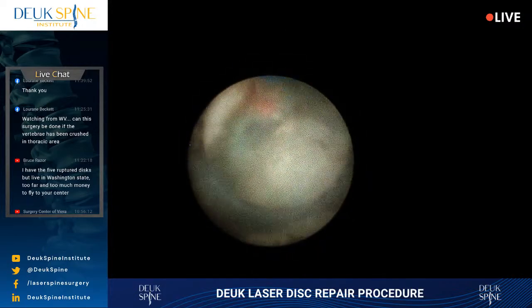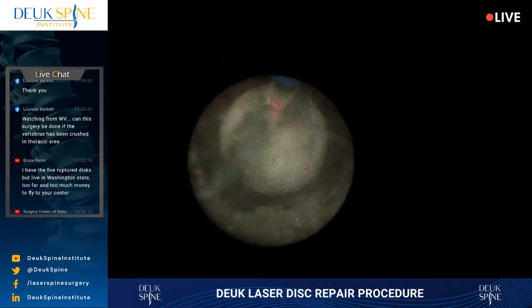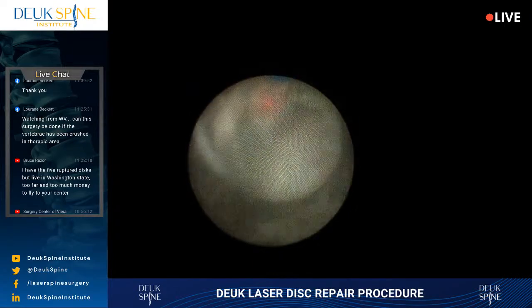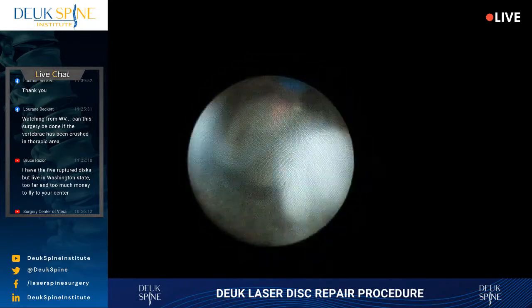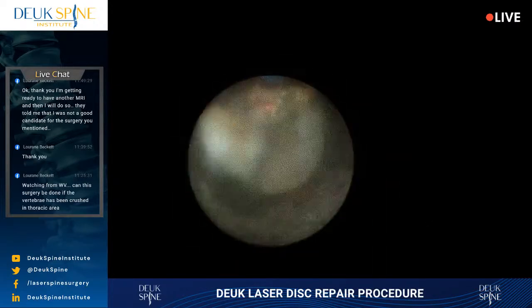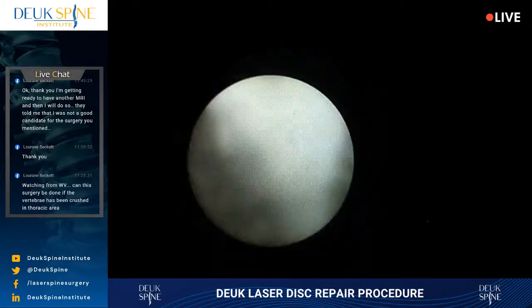Do I have to teach you all everything now? Just kidding. Just about done. Breaking up this herniation into little pieces and getting rid of it. Be done in 3 minutes.